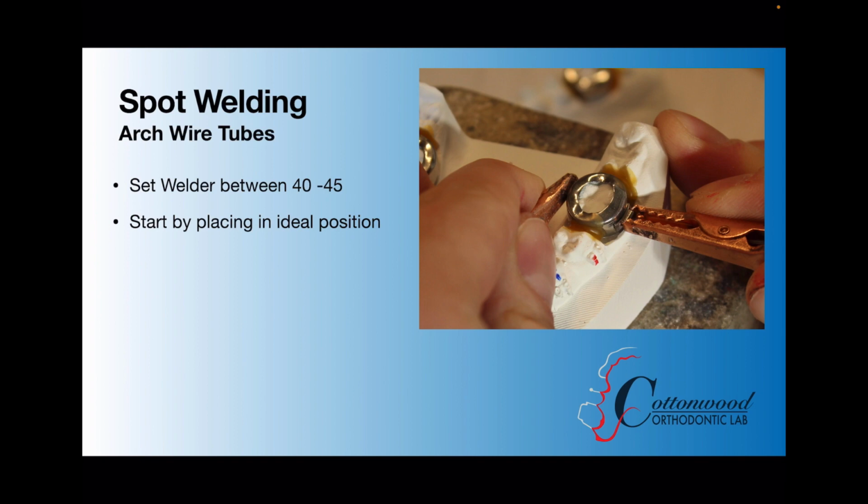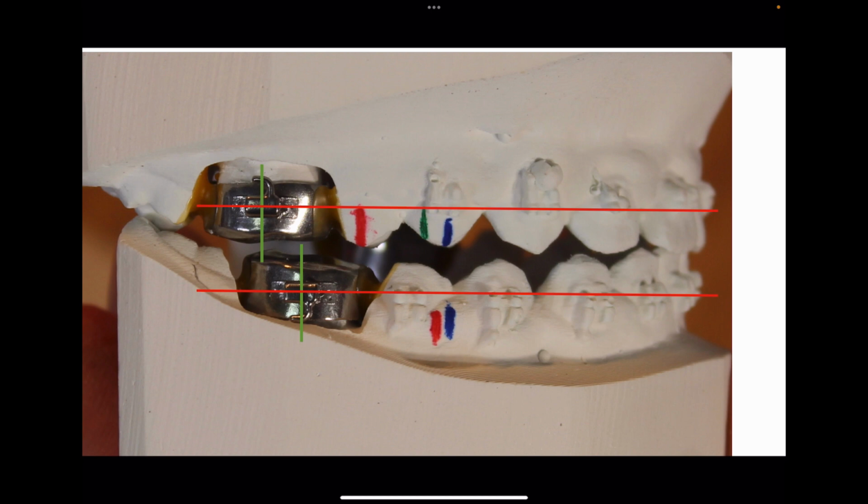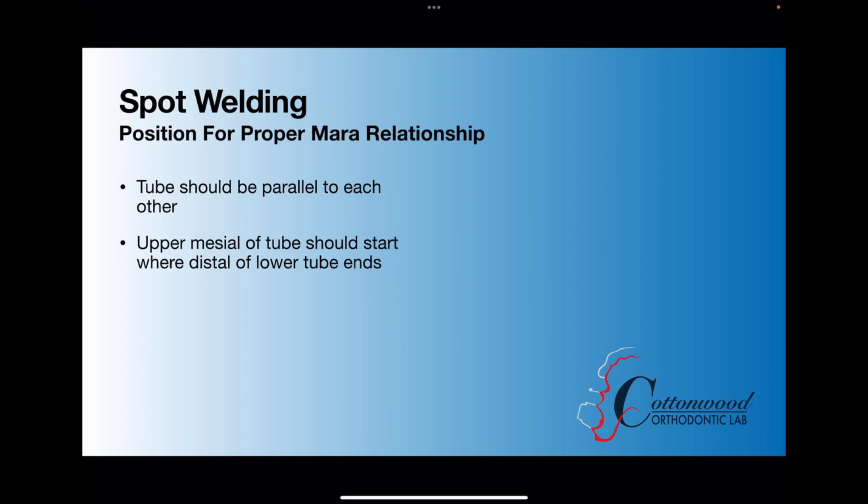We're going to set that welder to 40 to 45 and start just by placing those in ideal position. So you're going to want to shoot for those archwire tubes to be in the middle third of those molar bands or crowns, and then right in the center. And then the next assessment is you want to see how your archwire tube is going to line up with the rest of the model. You can see here it's not necessarily in the ideal position per tooth, but it is in that middle third, or the median third, of each one of those arches. And then you can see the green lines indicate that we're right in the middle of those molar crowns or bands.